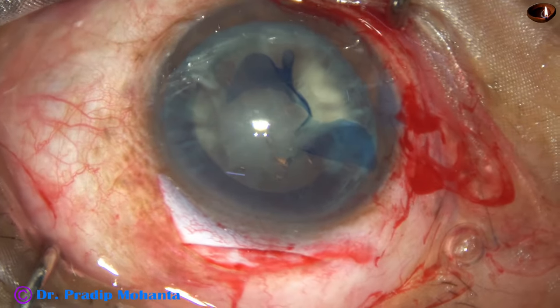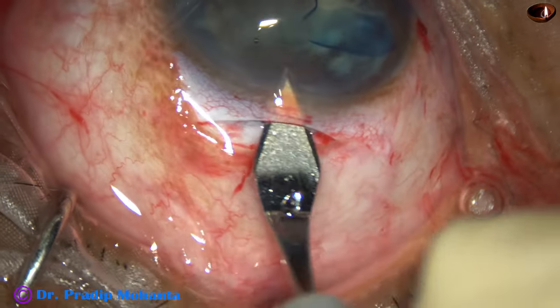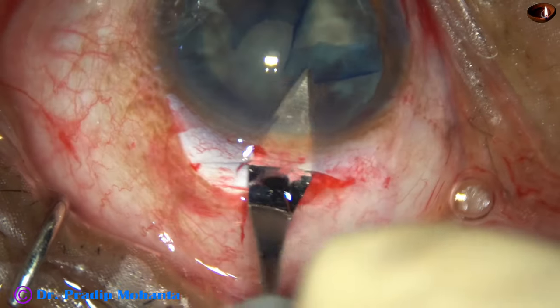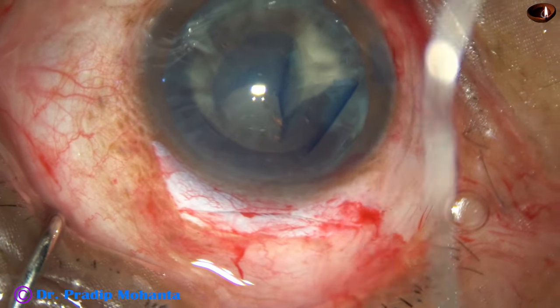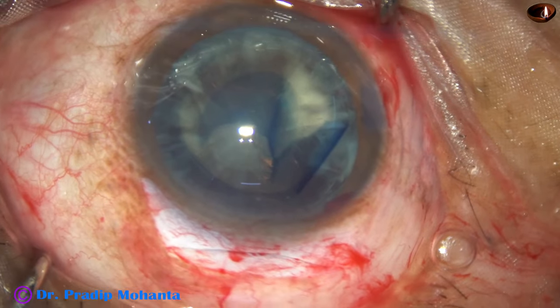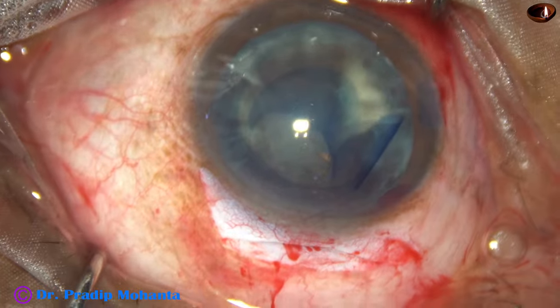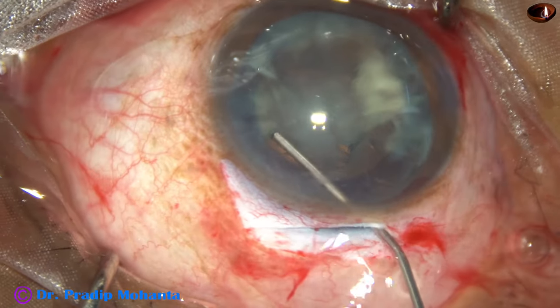We will see that the nucleus will not prolapse by hydrodissection, but we have other ways. Now the tunnel is opened. We go to the anterior extreme of the tunnel and then enter into the anterior chamber — do not come out, make the tunnel all at once. It is open from one side to the other side. And now hydrodissection is to be done. I take Ringer's lactate in a 2cc syringe and do the hydrodissection with a 27-gauge cannula.